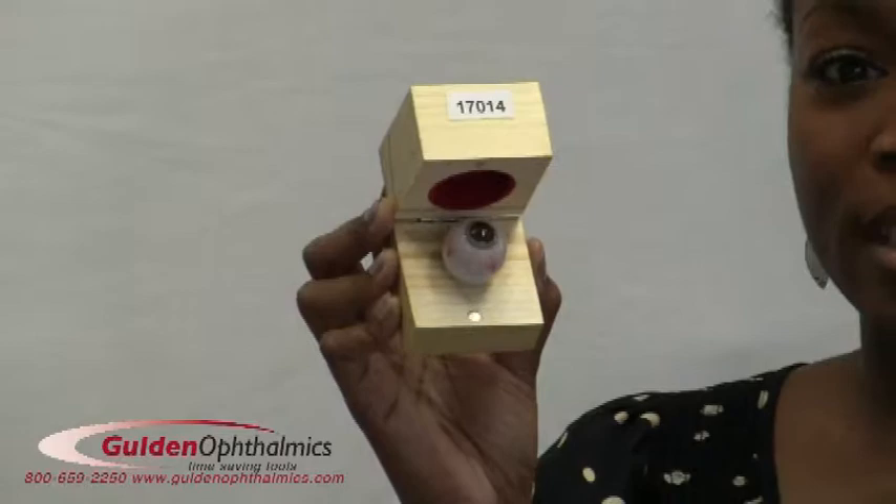All the essential structures of the angle are demonstrated and can be readily seen. This model is ideal for teaching, refreshing, and practicing gonioscopy skills, demonstrating and measuring the anterior chamber angle, and learning about developmental abnormalities.